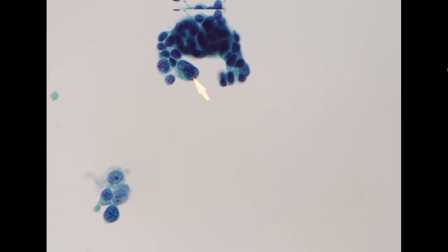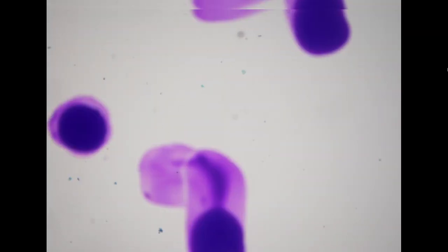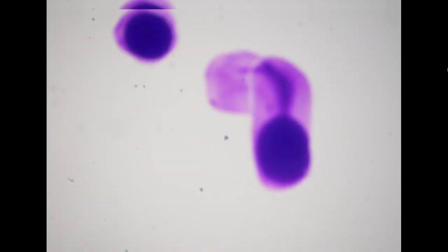So here we see a well-preserved cluster of cells with prominent hyperchromasia, pleomorphism, increased NC ratio, almost above 0.7. Some atypical cells, although these look like umbrella cells, still show high NC ratio and a little bit of hyperchromasia. So this is diagnostic for high-grade urothelial carcinoma.